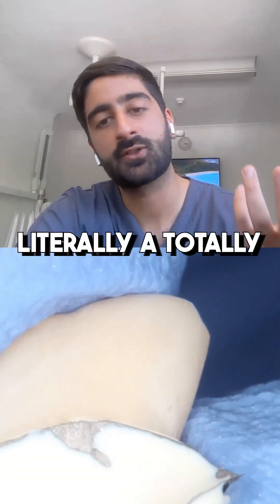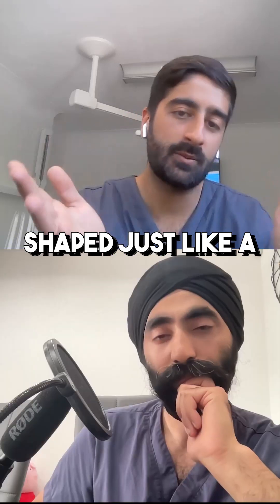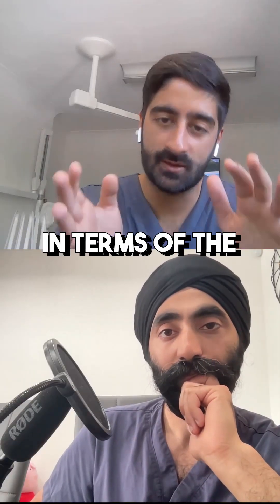The ovate pontic is literally a totally convex profile that sits against the soft tissues. It's shaped just like a tooth underneath it in terms of the bulbosity.